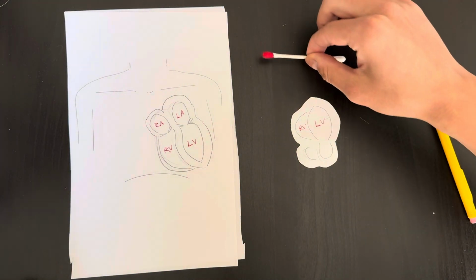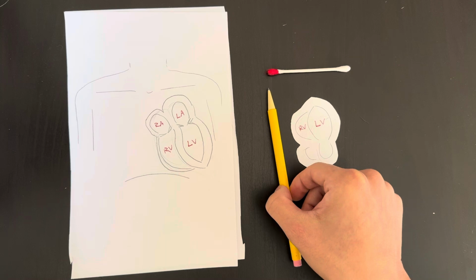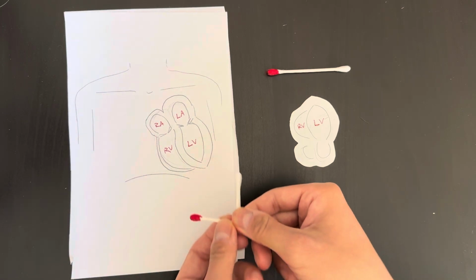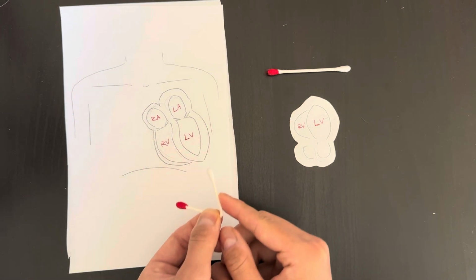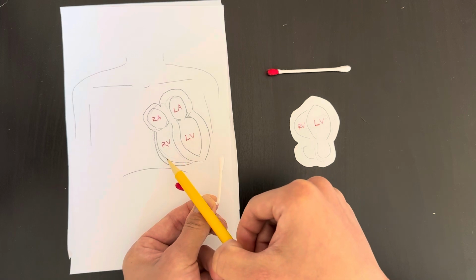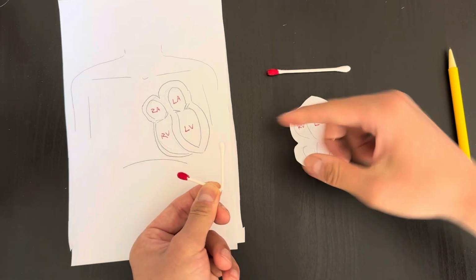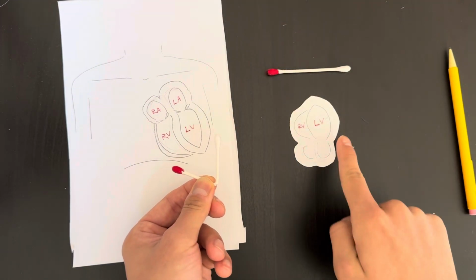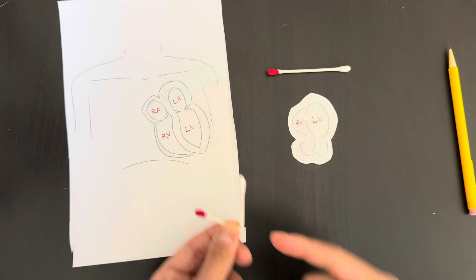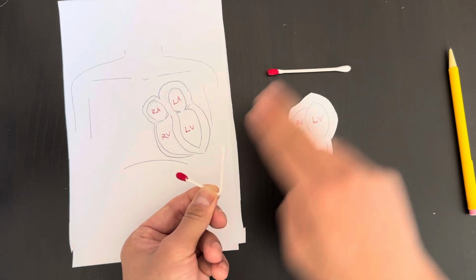If you're in a traditional radiology or POCUS setting, and your probe marker is on your left side, you'll notice it corresponds to the RV. So if I was scanning this patient coming from lateral at the apex of the heart, kind of the side lower wall of their chest, I would want my probe marker also towards their RV or their right side. So you'll notice the image, because we're coming from down up, is an up and down reflection of real life, right? Because on the screen, I see LV on top. In real life, LV is towards the foot of the patient, but I'm coming from below. So it's an up and down rotation, but the side to side still maintains the same orientation.